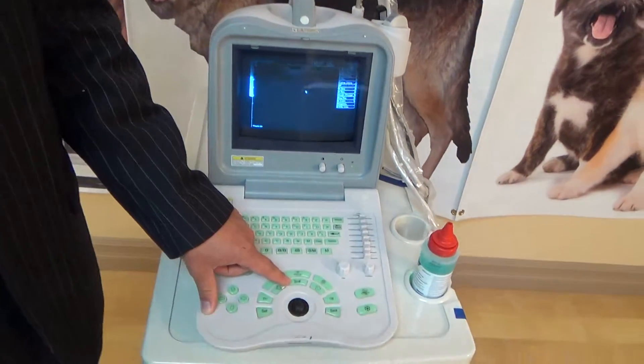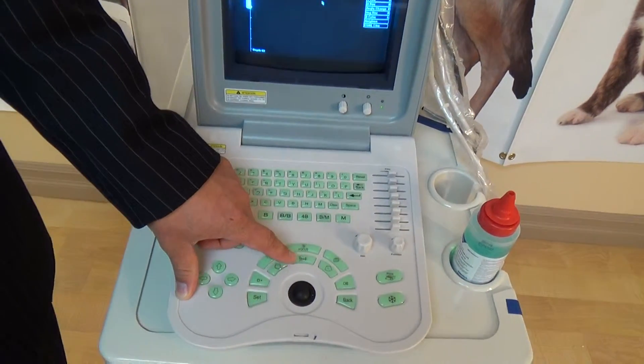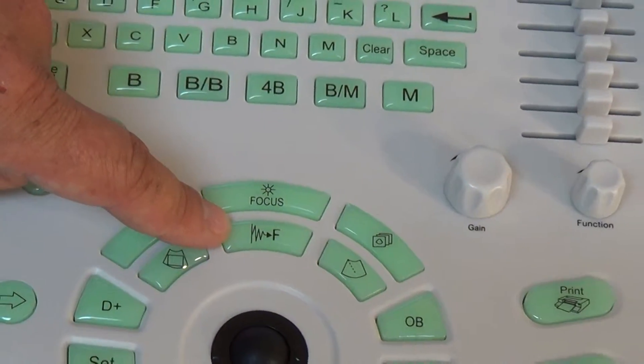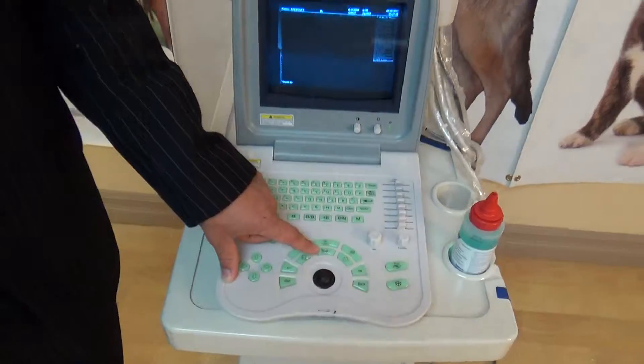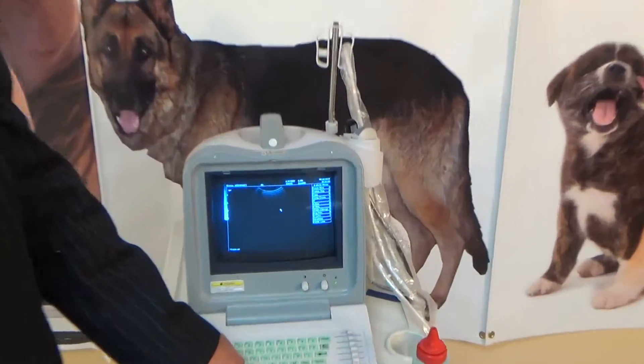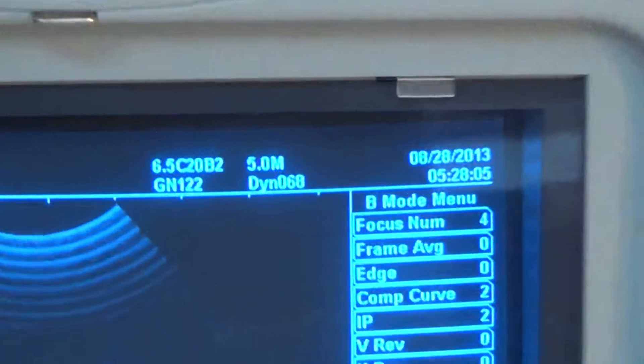The other button you're going to use a lot is the waveform button followed by an F. This basically controls the frequency you're using for the specific ultrasound probe. With this machine you can adjust it from 9 all the way down to 5 megahertz in this setting.